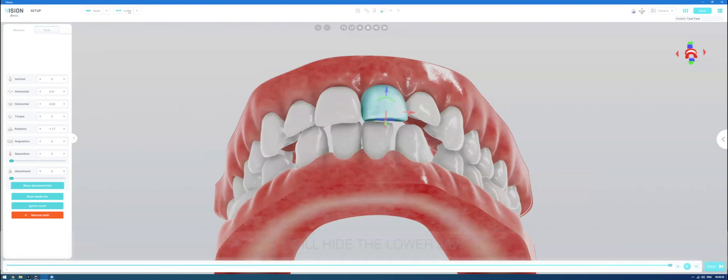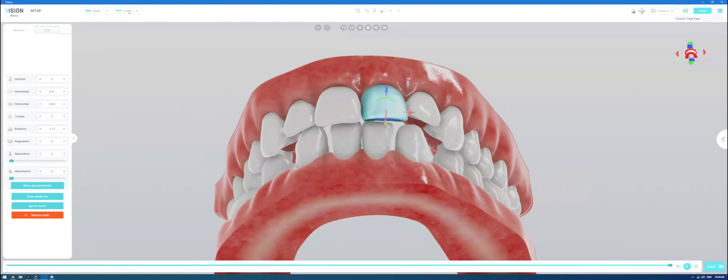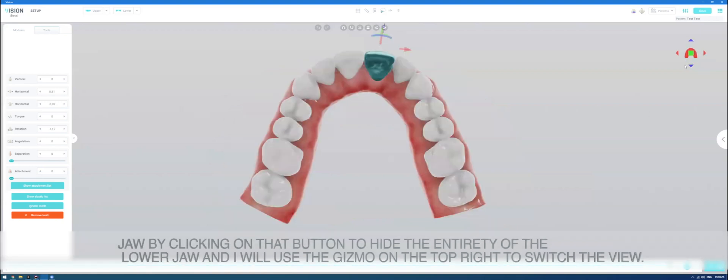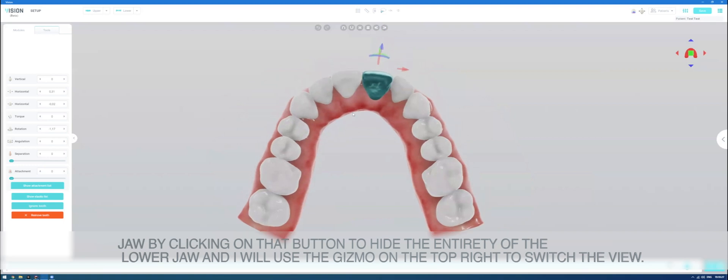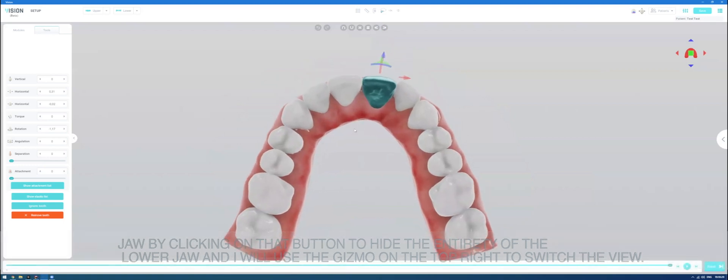I will hide the lower jaw by clicking on that button to hide the entirety of the lower jaw and I'll use the gizmo on the top right to switch the view.